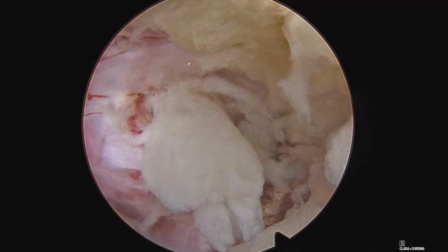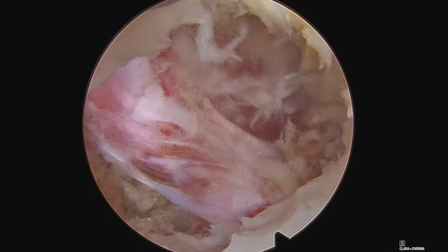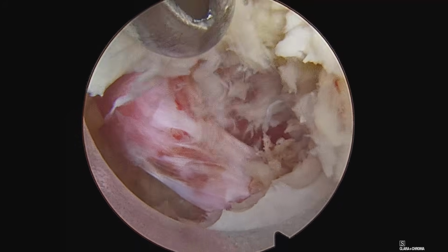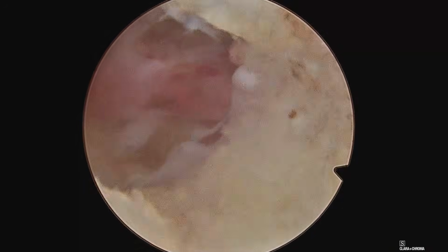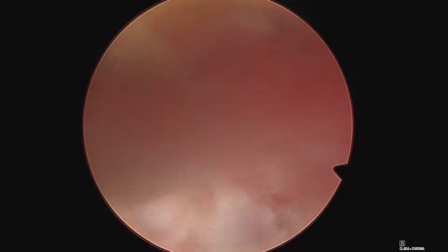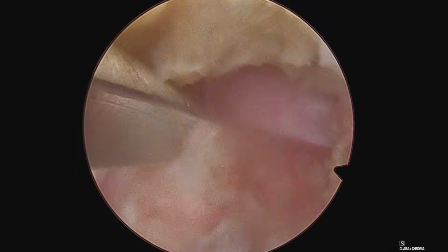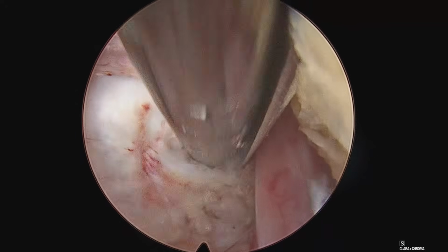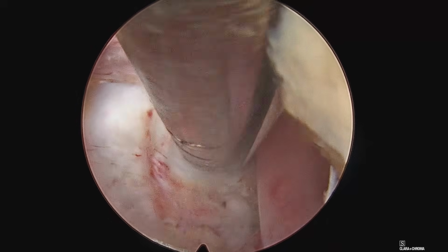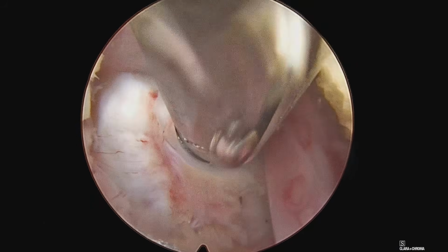So here there is another piece which is being removed, and as we are removing these pieces, the axilla is getting gradually decompressed and clear. Whenever you remove fragments, you will have some bleeding, which can be dealt with radiofrequency. Here, a root retractor is being used to excise part of the L5-S1 disc fragment, pushing the traversing S1 root medially.